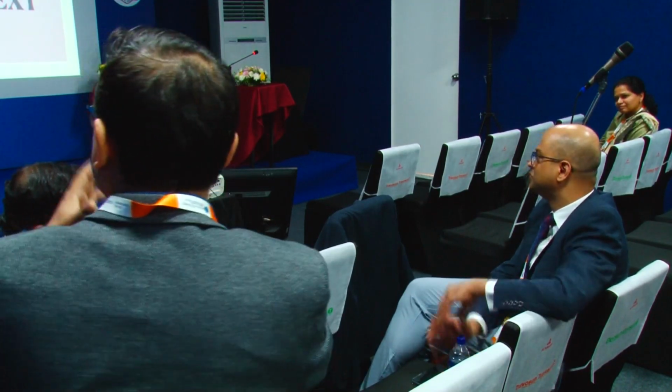Also, one particular problem that I personally found when I tried the VR headset is that there is a background luminance. It's not a non-illuminated background. It is an illuminated background on which you get to see these flashes. So it creates a sort of weird effect. It's said that it's easier, but I personally felt it's more difficult. It was creating something that I felt was abnormal.